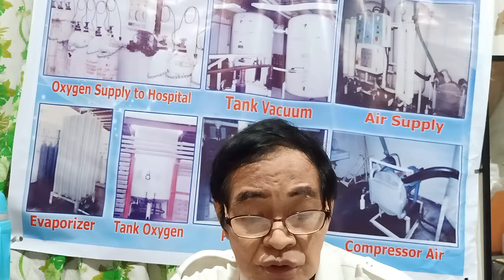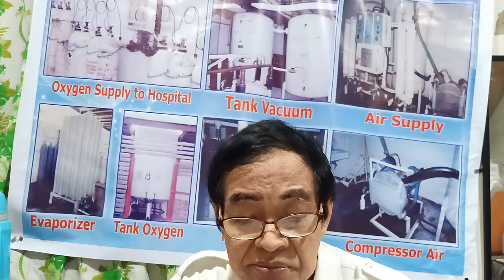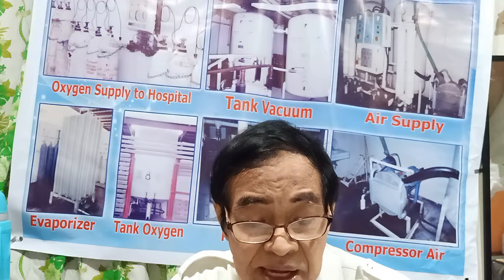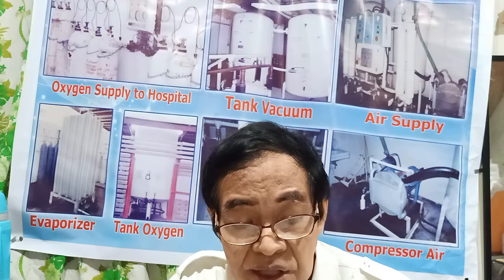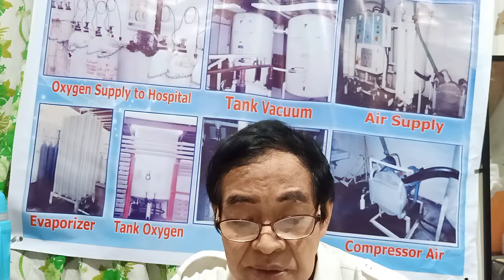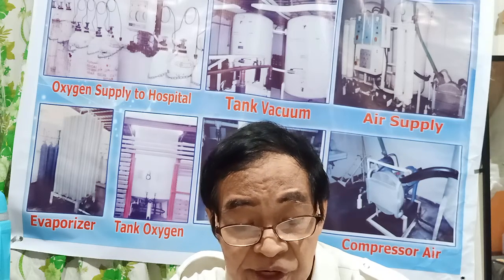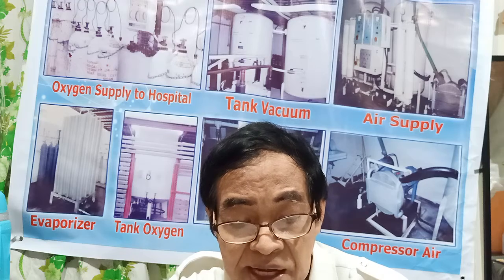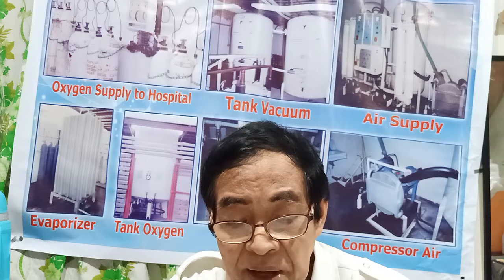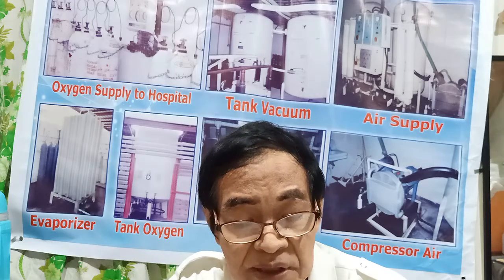Each of the two safety valves on the tank has sufficient capacity to evacuate the gas that could evaporate in all foreseeable operating disturbances, including a fire in the immediate vicinity of the tank.